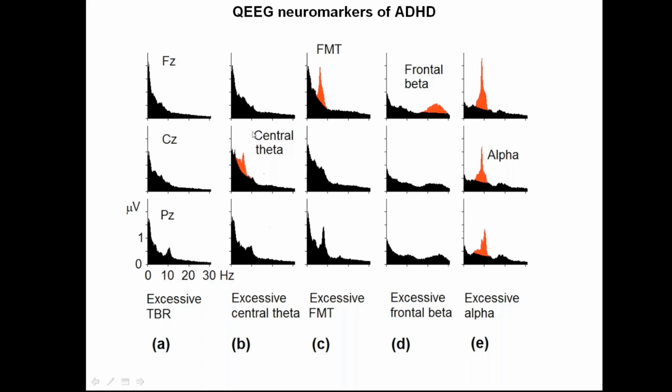So here I present the groups that were derived on the basis of EEG spectra.